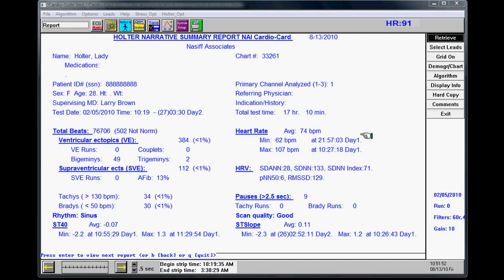You'll see the average heart rate, the minimum, the maximum, your HRV, and number of pauses.